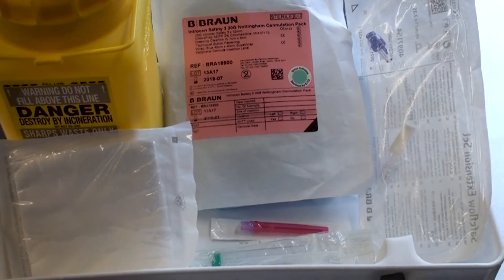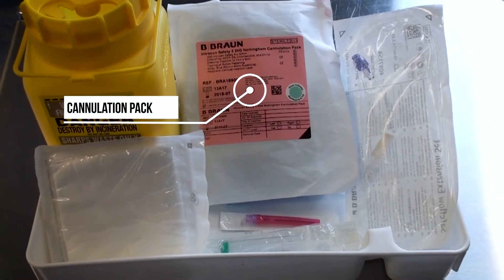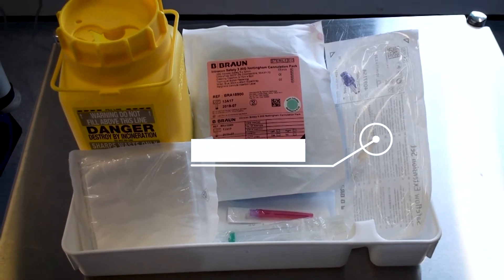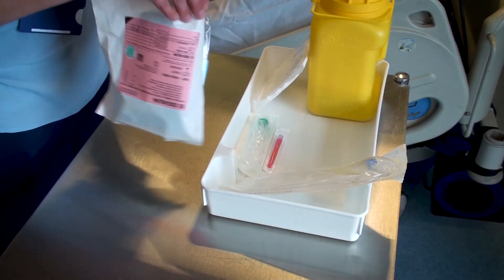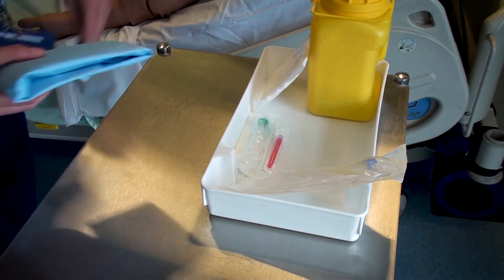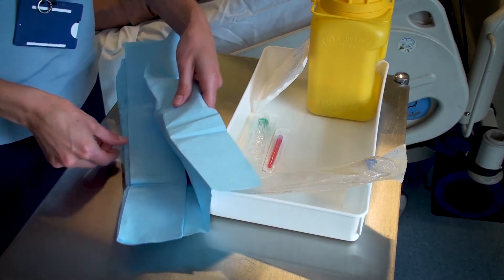The equipment required for this procedure is the appropriate size venous cannula, tourniquet, non-sterile gloves, skin preparation wipes, an octopus or extension set and a syringe with saline. In this example, we are using the Nottingham University Hospital's cannulation packs. These contain a non-ported cannula, but ported cannulas may be used.